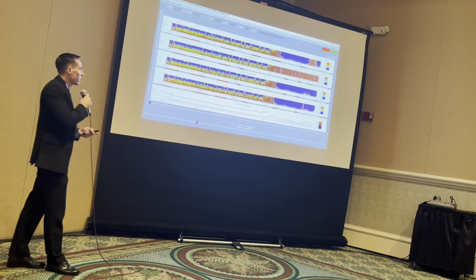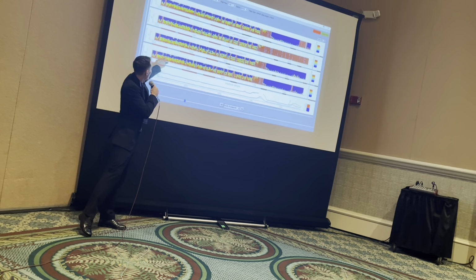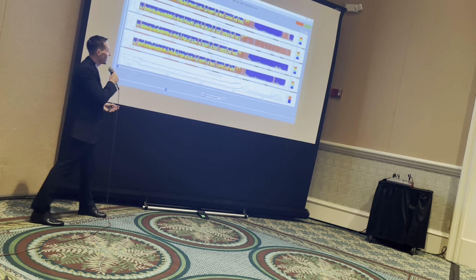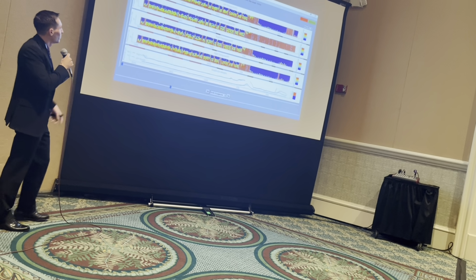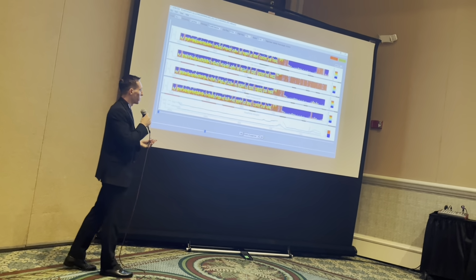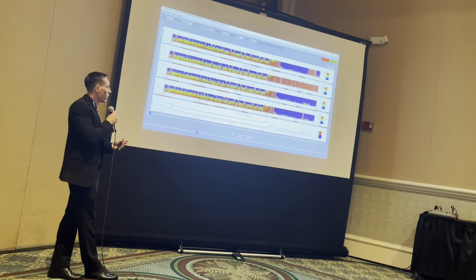Now here I have another pretty cool example, I would say. In this patient, if you count the background around 10 waves per second, it's not as beautiful as the first example we saw. It might be a little bit of a few red specks. It's a little harder to see. Not everyone has as beautiful a background as everyone else. And in this example, this patient has epilepsy and has what are called interictal epileptiform discharges. So in between their seizures, they're having these spike and wave activity, but it only happens for about 1 second.